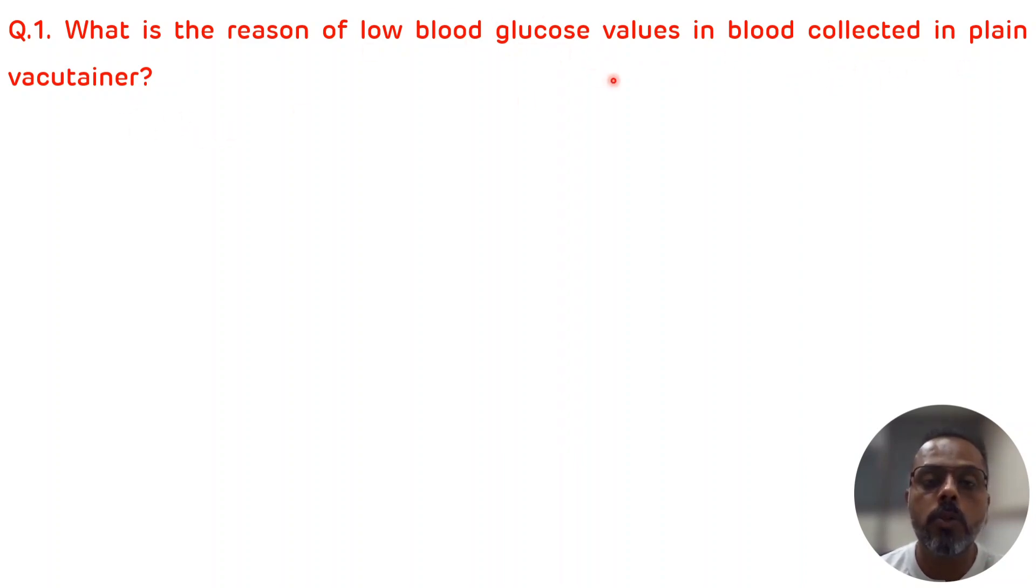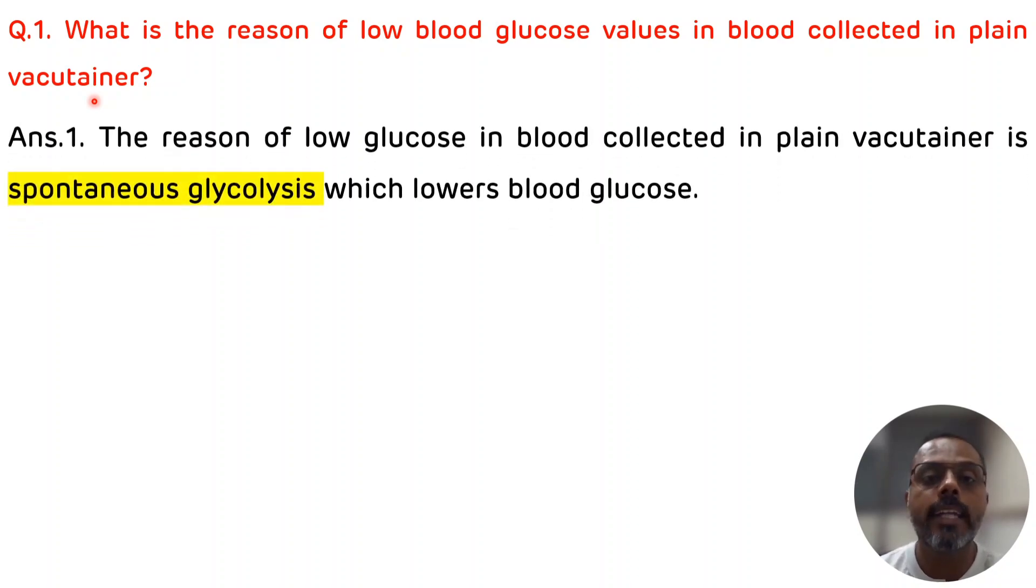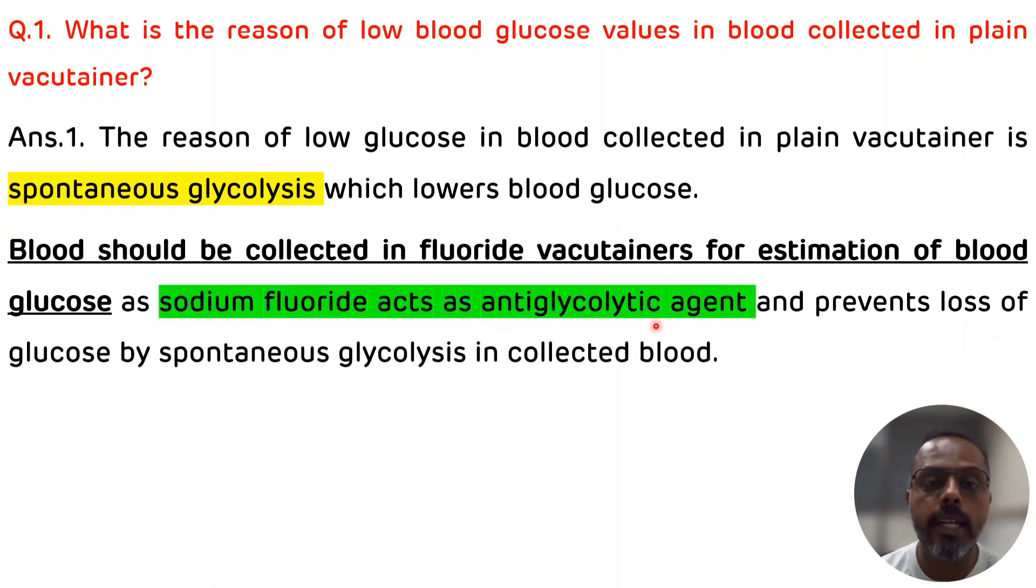The reason of low blood glucose value in blood collected in plain vacutainer is plain vacutainer doesn't contain any anti-glycolytic agent. There will be spontaneous glycolysis occurring which results in low blood glucose. So the correct vacutainer for the collection of blood for glucose estimation is sodium fluoride vacutainer. Sodium fluoride vacutainer contains fluoride as an anti-glycolytic agent which will inhibit the enolase enzyme of glycolytic pathway, so there will be stoppage of glycolysis.